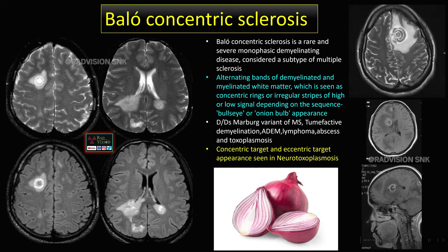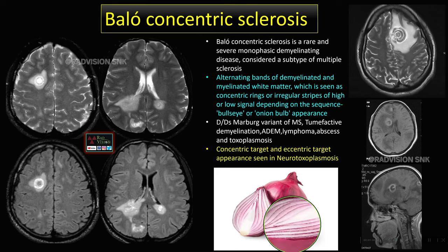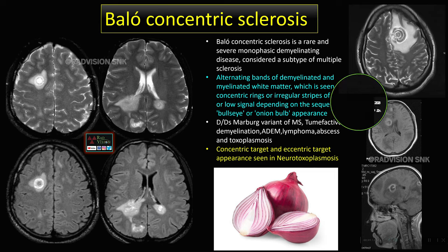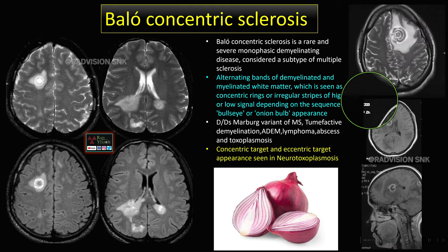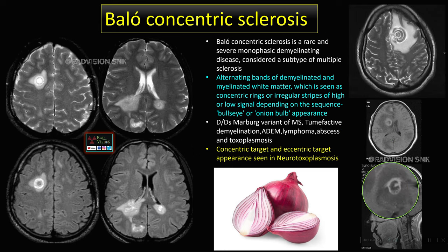This is a classical case of Balo's concentric sclerosis — a rare and severe monophasic demyelinating disease considered a subtype of multiple sclerosis. Alternating bands of demyelinating and myelinating white matter are seen, which mimic the bullseye or onion bulb appearance. Differential diagnoses include Marburg variant of MS, tumefactive demyelination, ADEM, lymphoma, abscess, and toxoplasmosis. In neurotoxoplasmosis, a concentric target and eccentric target sign are seen, which helps in differentiating neurotoxoplasmosis from Balo's concentric sclerosis.